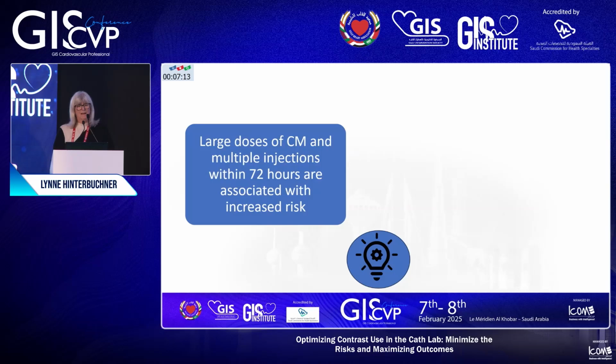What can we see? One thing that you should see, kind of like the emergency ambulance, watch out, this patient's had a staged procedure. So they were in yesterday or the day before, and they already received quite a load of contrast. And they're in today for that second part of the staged procedure. They're somebody that should be really watched because of the high cumulative dose of the contrast.